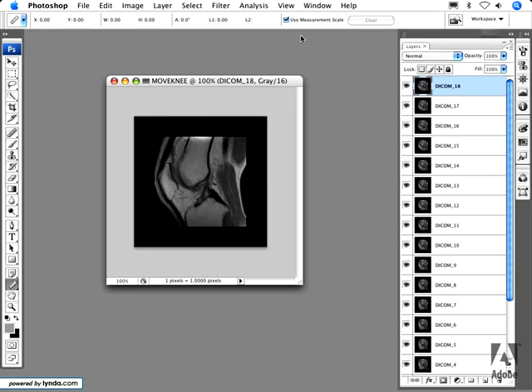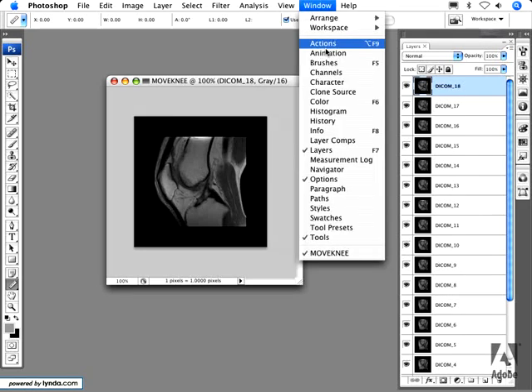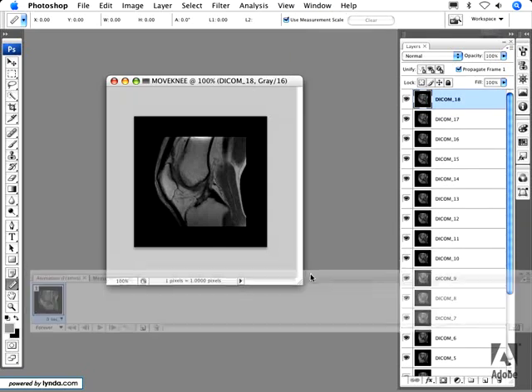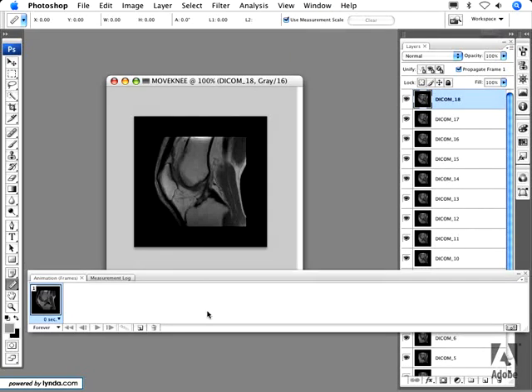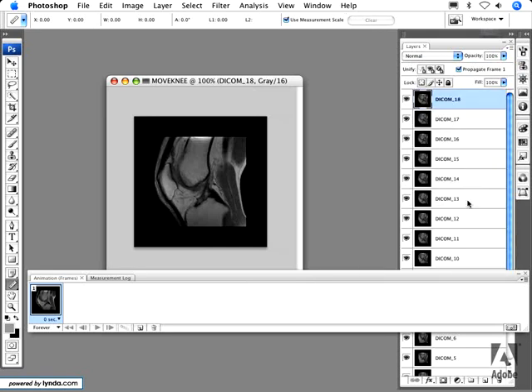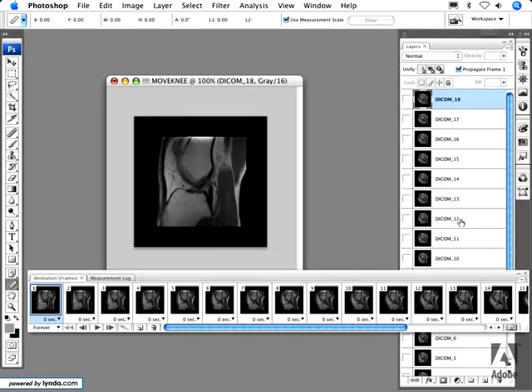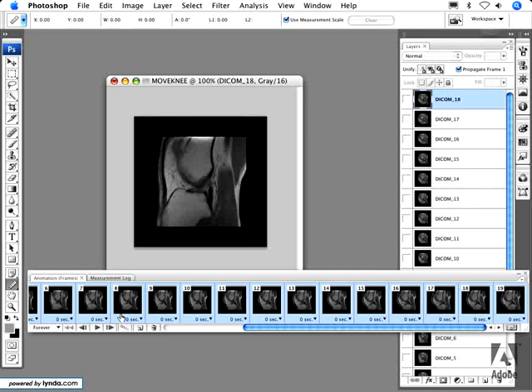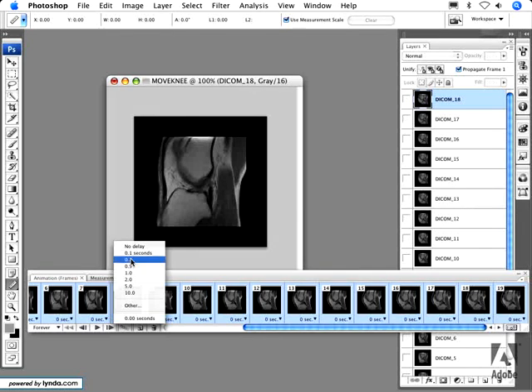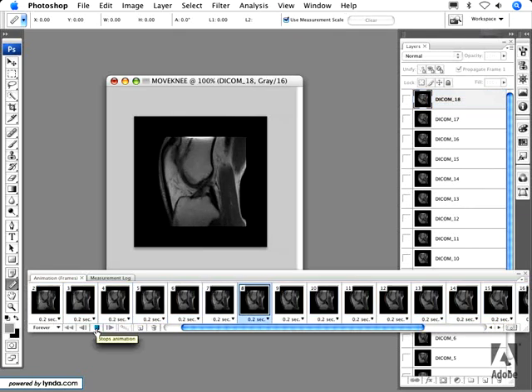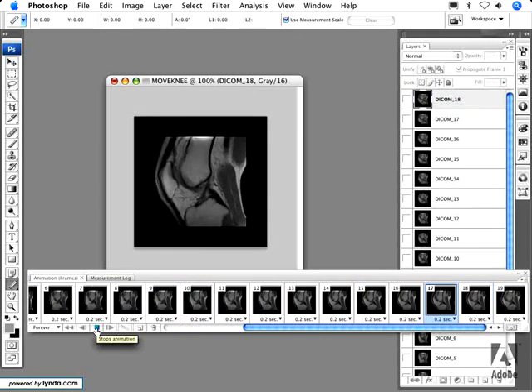One last thing to show is how to create animations from a series of images such as DICOM images. When you go to the Animation palette and choose 'Make Frames from Layers' from the flyout menu on the far right, it will import each individual Photoshop layer as a single frame in your animation. You can then select all frames, set them to the same duration — such as 0.2 seconds — and when you press Play, you get a nice animation, for example of a knee bending.